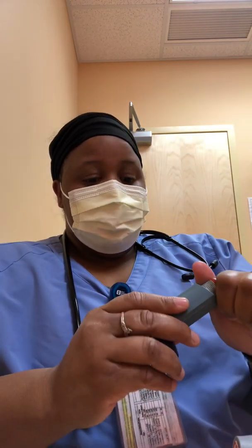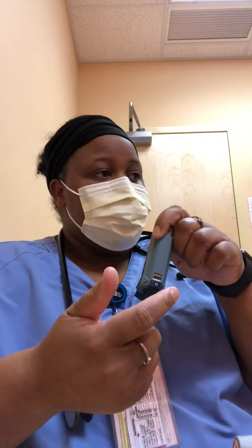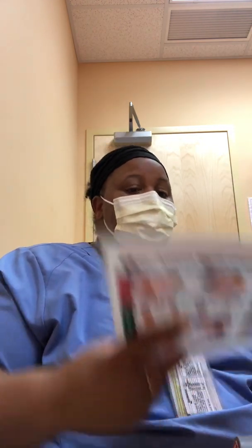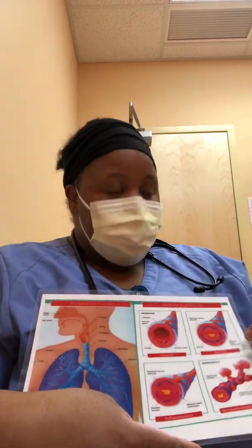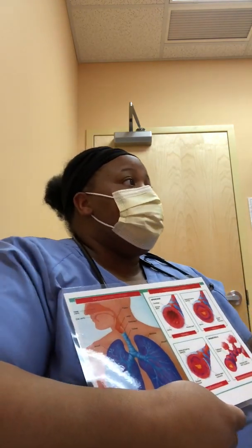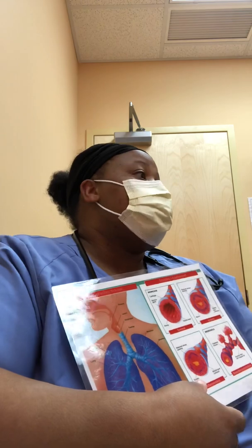This is the Ventolin albuterol inhaler, and I go over that it's a meter. It gives out your exact dose that you're going to get. And we have these little handy dandy guides. I hope this isn't cheating, but this is something that I do every day. I go over how these medications help the airways. I explain this to parents because we have to document whether we explain it to grandma, mom, and child.